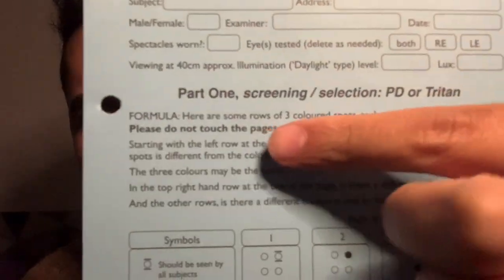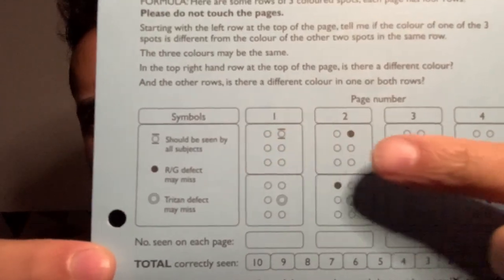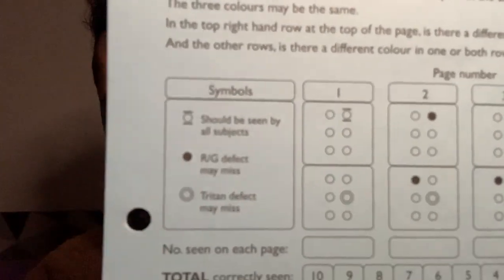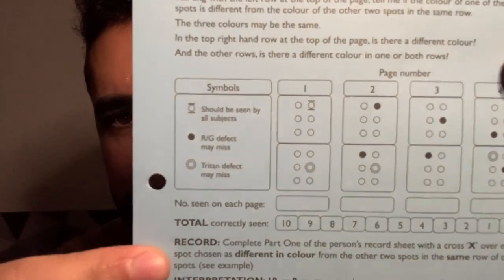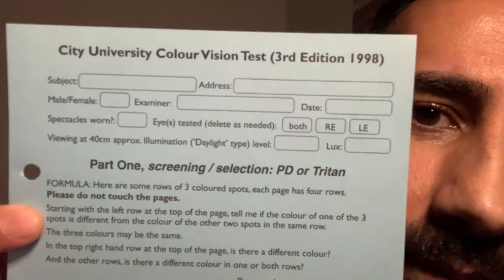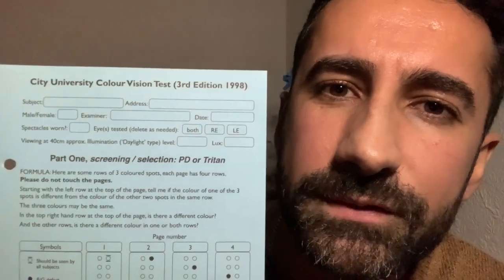For part one, this is where we screen for a colour defect. I will mark your answers in these blocks here and give you a final score. At the top is where I put all your important information: name, address, and examiner.